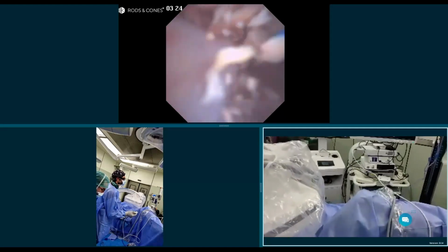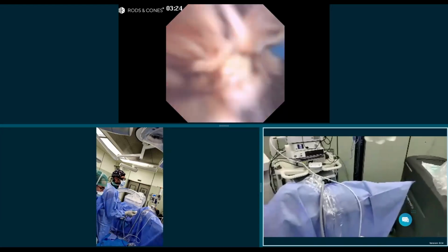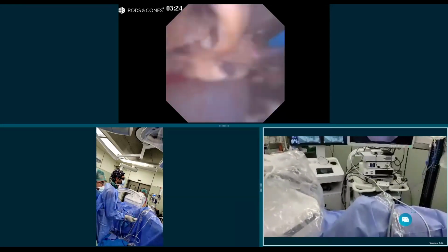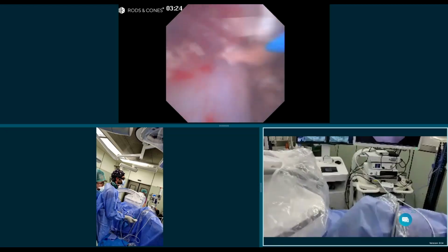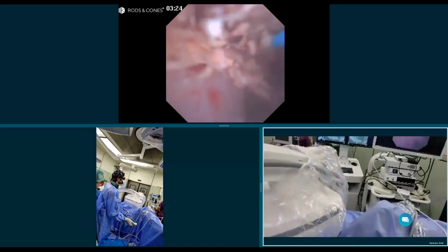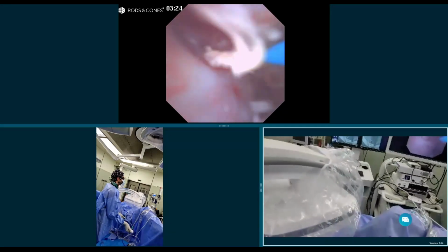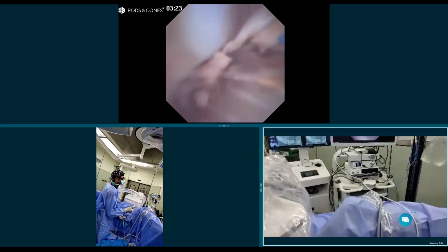So this is also important to have a more effective procedure. I have increased at maximum the settings, 1 joule 20 hertz, so maximum 20 hertz to be on the safe side. So not very high frequency, just 20 hertz, 20 watts, which is the important parameter. And I have as much energy as possible, which is 1 joule. And you can see here that with that and a long pulse modulation, you can have good, efficient popcorning very quickly. These stones are already less than or very similar to my laser fiber, which is, remember, 0.2 millimeters.